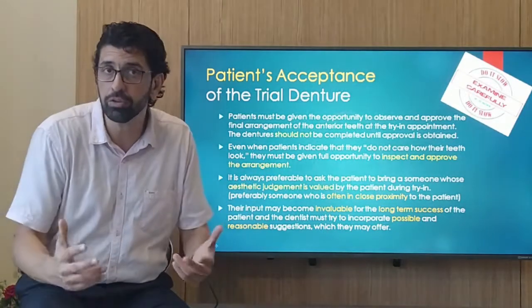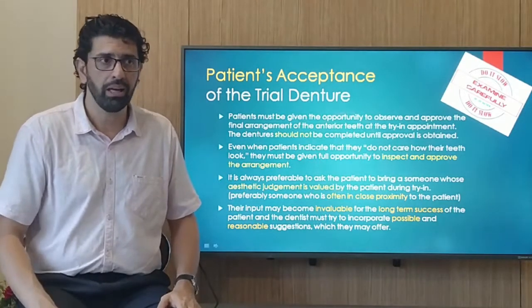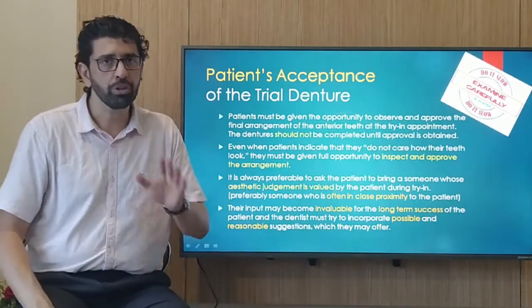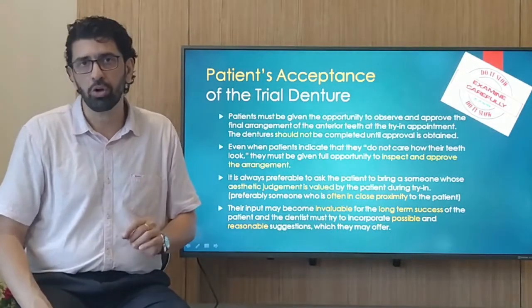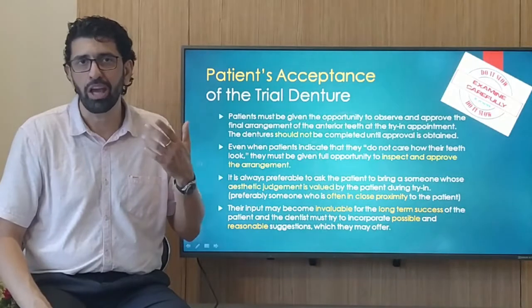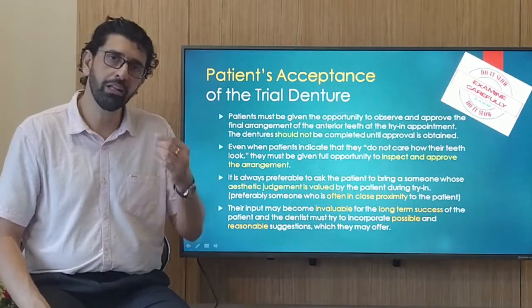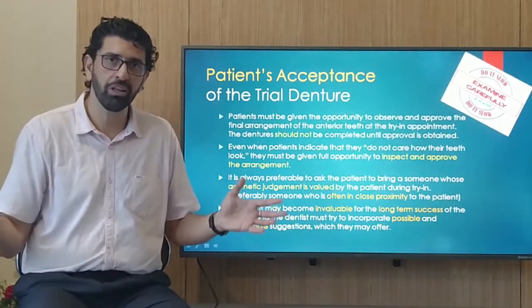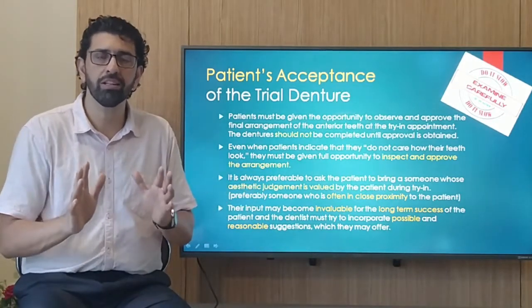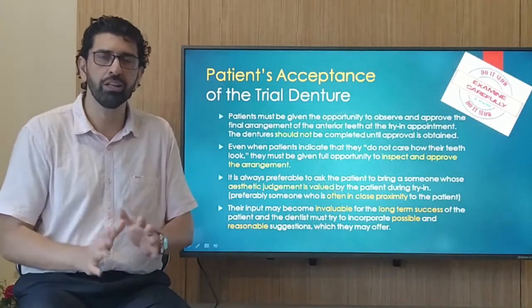So if they give you some input, be open-minded to receive as much as is reasonable and practical, and tell them what the difficulties are if they make unreasonable demands, and come to a compromise somewhere. Because remember, you are not the final person to make that call. The patient is the one who's going to have the denture, and she's got to live with that denture day in and day out for the next couple of months or years. You're just going to deliver and insert the denture, and forget about it after a couple of post-insertion recalls. So for this reason, make sure the patient has a final say and is happy with the trial denture before you quit the try-in appointment.